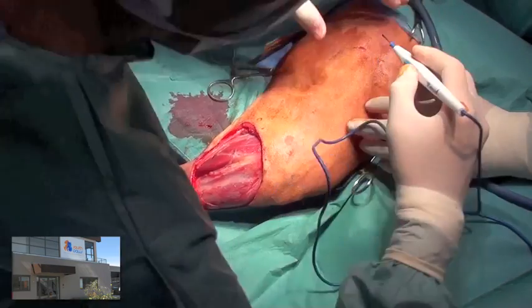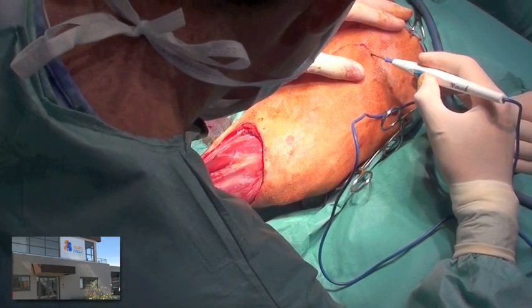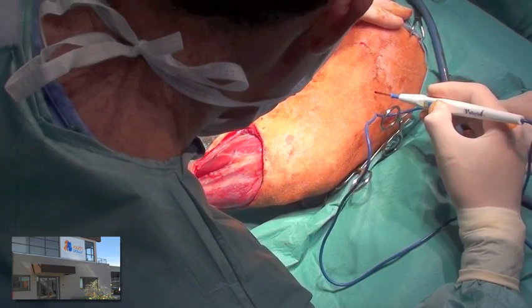Electrocautery is used to mark the skin for the proposed axial pattern flap, which is based on the lateral geniculate artery.